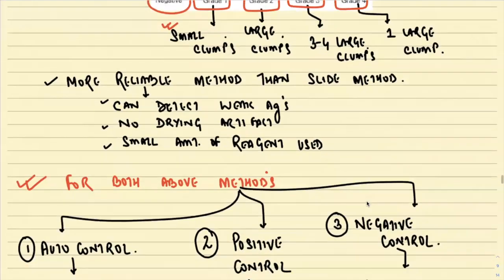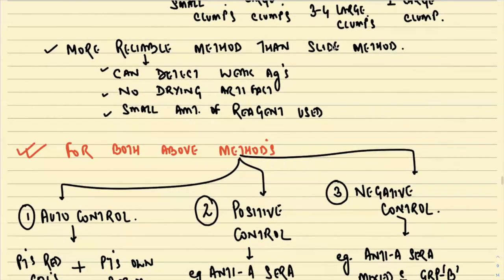Now, if you compare with the slide method, this method is far more reliable, because it can detect weak antigens also, as it is a sensitive test. Again, because everything is in the liquid state, there will be no drying and clot formation.